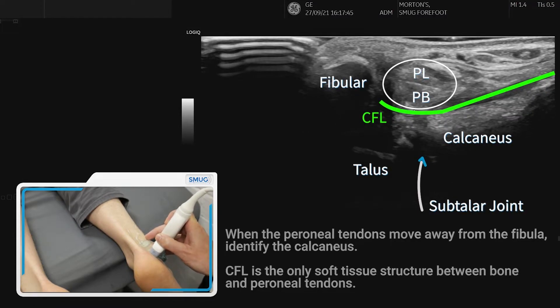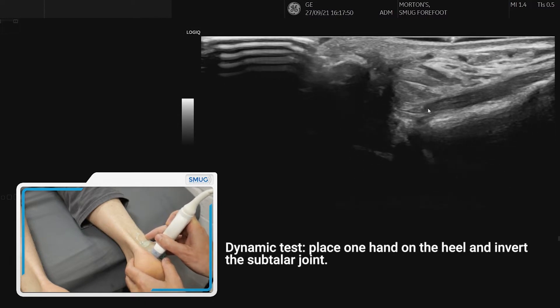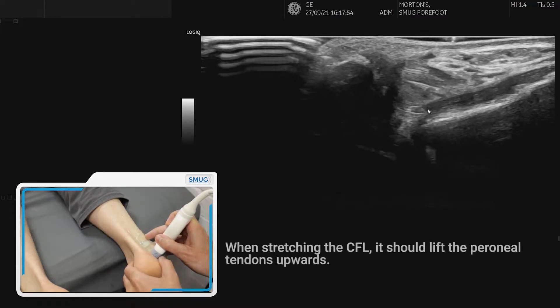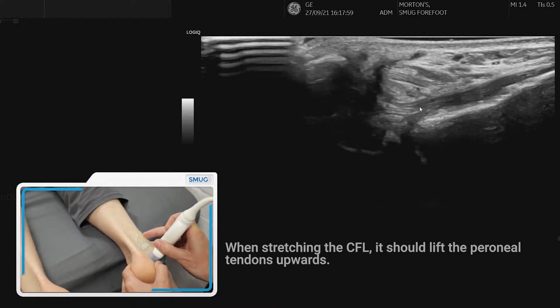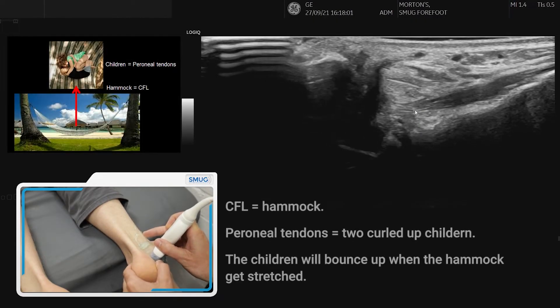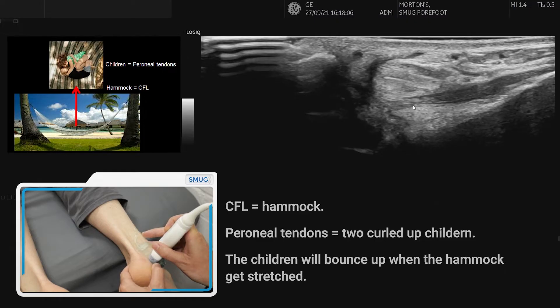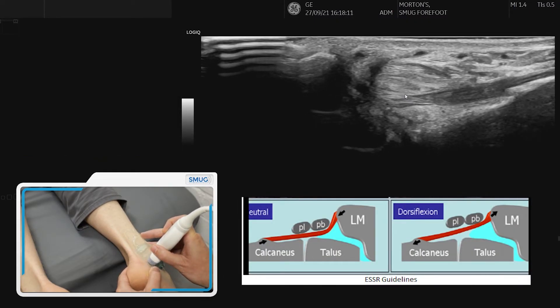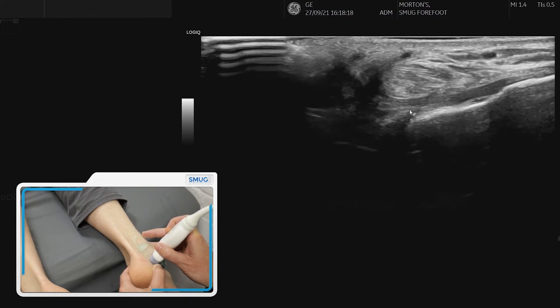To assess the calcaneofibular ligament fully we need a dynamic assessment. Put your thumb close to the end of the probe and invert the foot — this just lifts up the tendons on top so the ligament straightens. You can see the nice fibrillar alignment of the calcaneofibular ligament. Stretching into inversion you can see the ligament go really tight — that tells us the ligament is intact.